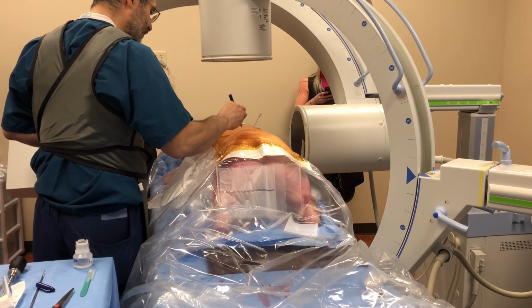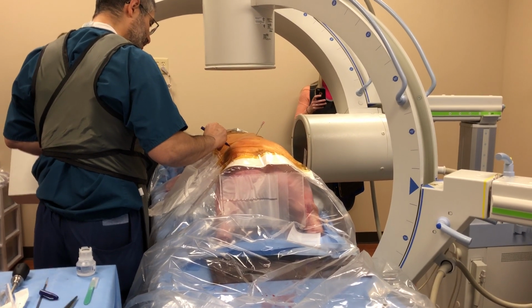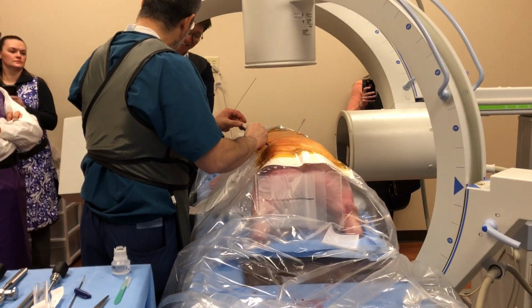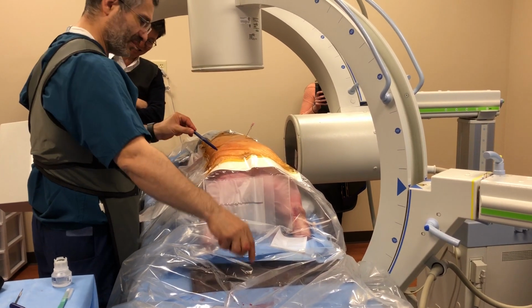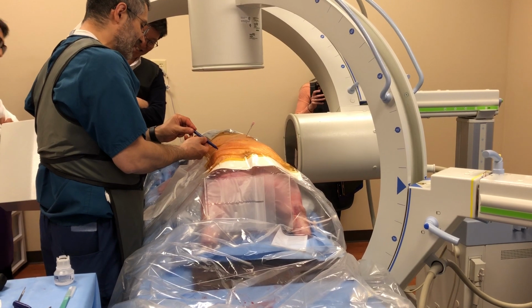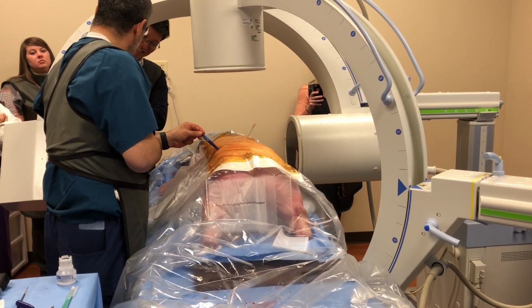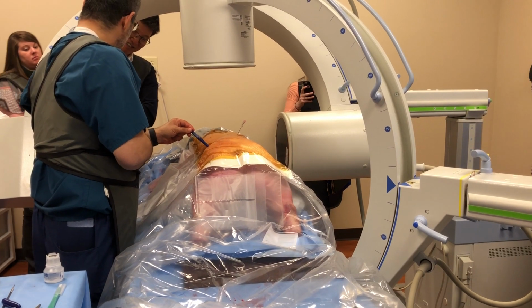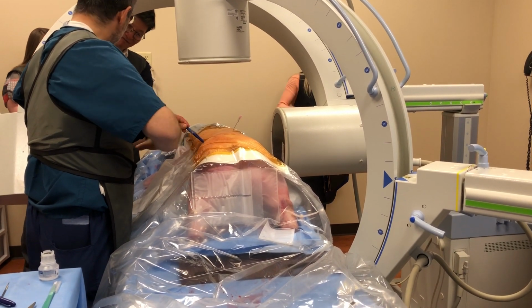First of all, you don't use this or this. You come a little like that, and then you add another aspect to that. Are you feeling this? And then the other aspect is you come here as well, oblique, and more like a direct lateral.